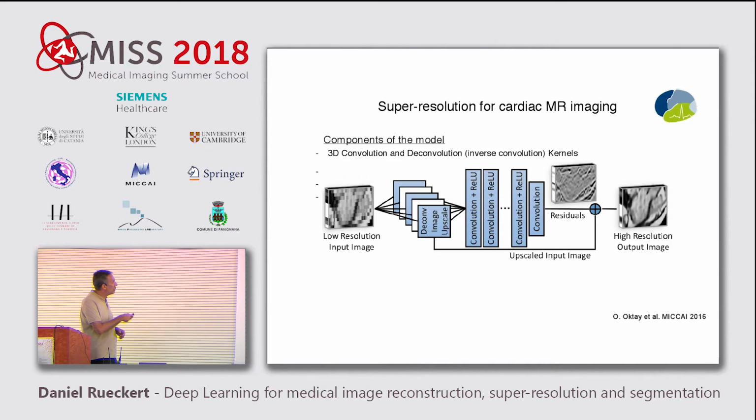The problem with this is that it takes around 40 seconds of breath hold to acquire this data. So perhaps most of you can still do this. If you have heart disease, you're no longer able to hold your breath for 40 seconds. So you're absolutely right. In principle, I could do it with this 3D data. Okay?